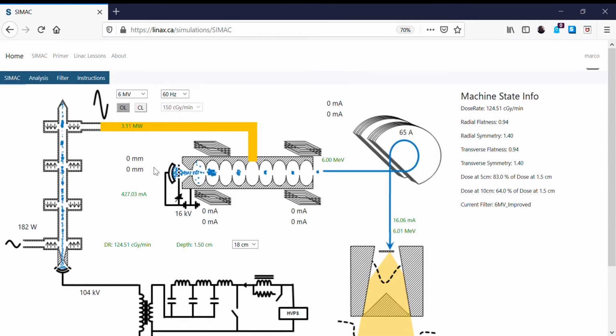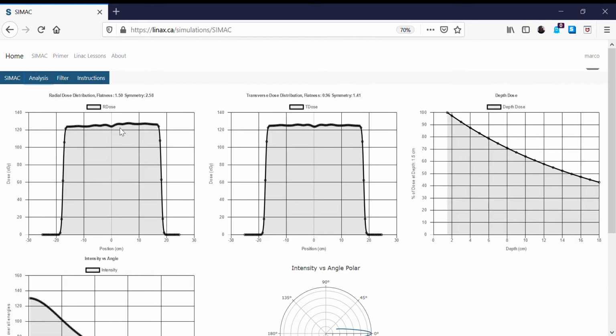To illustrate this, I'm going to introduce a radial gun error of just a small amount, something like 0.03 millimeters. This means that in the radial direction, the beam emerging from the gun is offset just a little bit, and this can happen for a number of reasons within a gun. Now when we look at our analysis tab, the beam is not perfectly flat. It's a little more intense over here on the right side in the radial direction than it is on the left side.